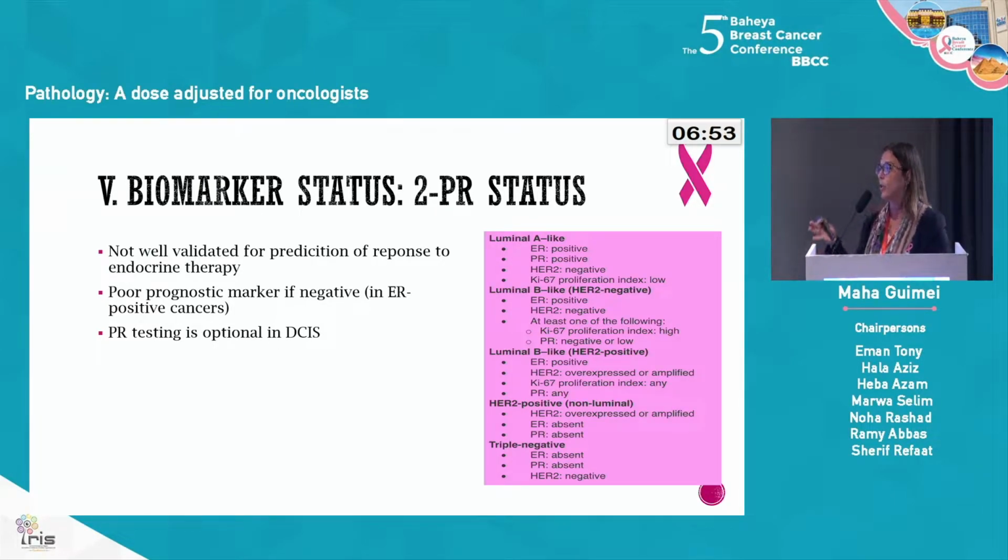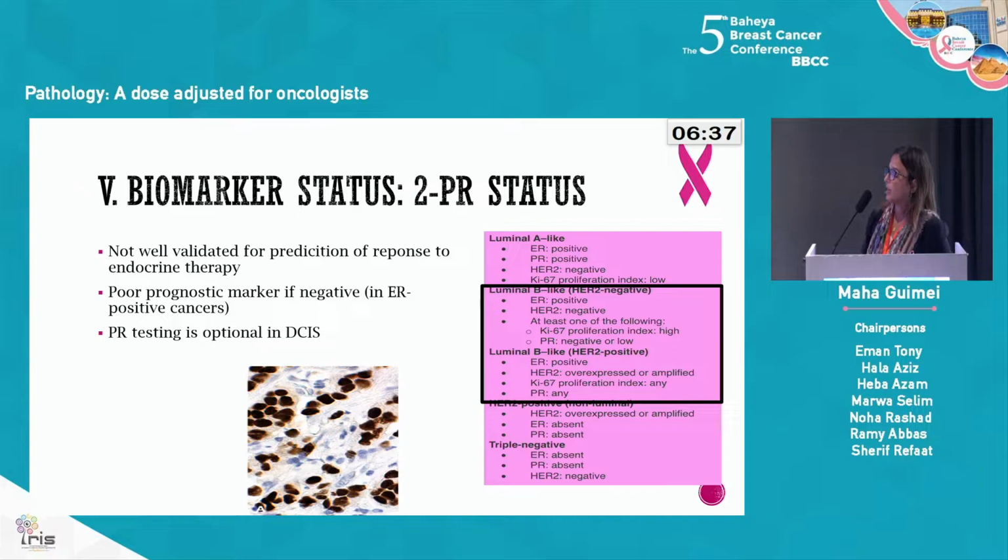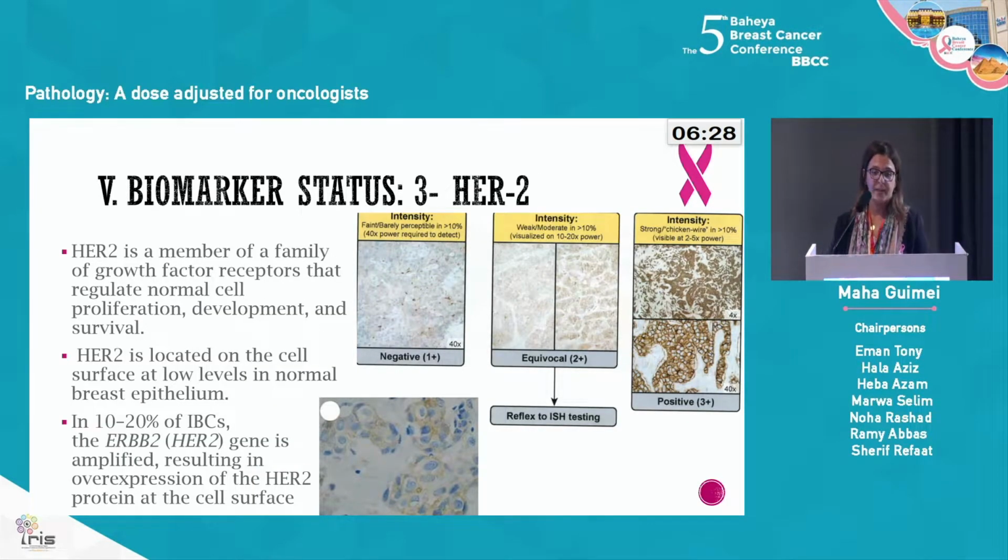الحاجة الثانية إن its use في ال DCIS is optional. مع DCIS الجايد لاينز بتقول إن لازم نعمل ER بس مش لازم نصبغ بالبي آر. ده برضو الستين it's a nuclear stain، فبنشوفه زي دوتس بني staining the nuclei of the cells. وده الجزء في الكلاسيفيكيشن اللي بيقول لي إن في نوعين من اليومينال بي. لو البي آر نيجاتيف ده بيخليها luminal B مش luminal A. هنتكلم عن الكلاسيفيكيشن دي كمان شويه.